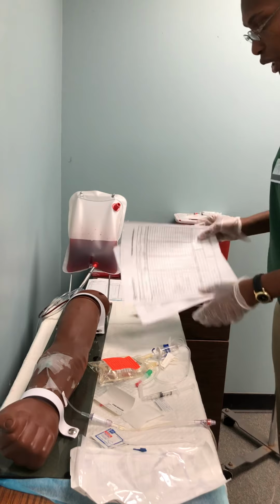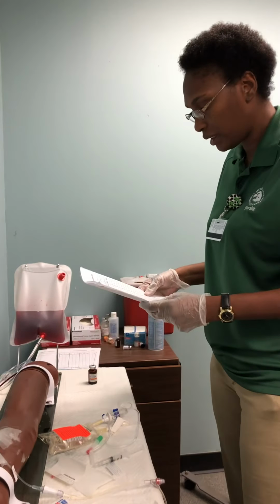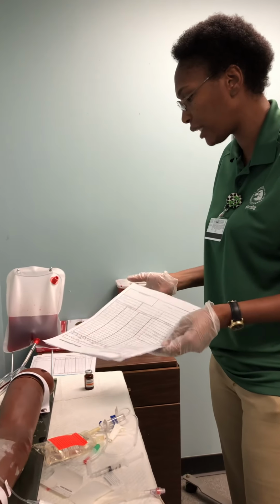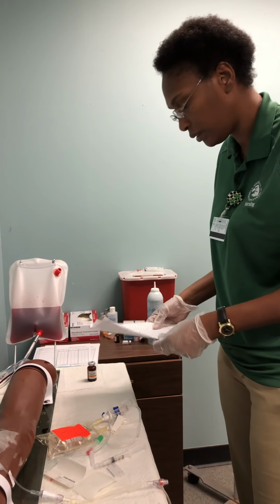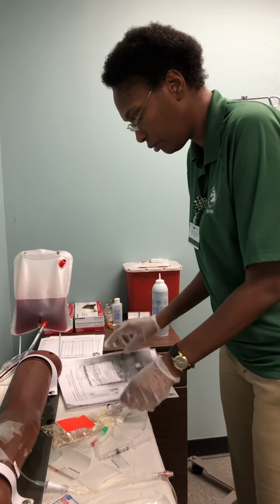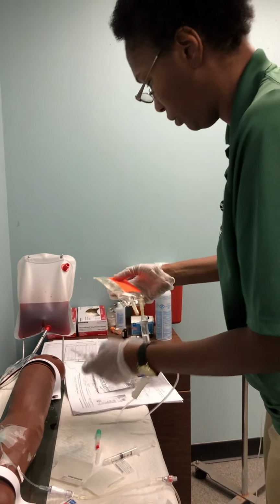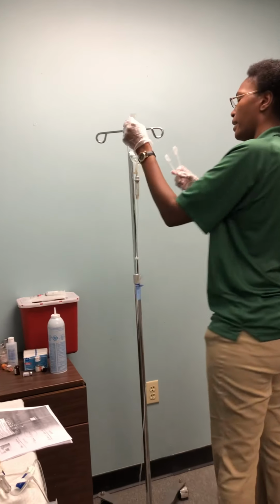I would teach my patient that the Lasix could cause dizziness or muscle cramps. Report any of those signs and symptoms to me immediately. And please use the call bell for assistance. I'm going to lower my primary bag.